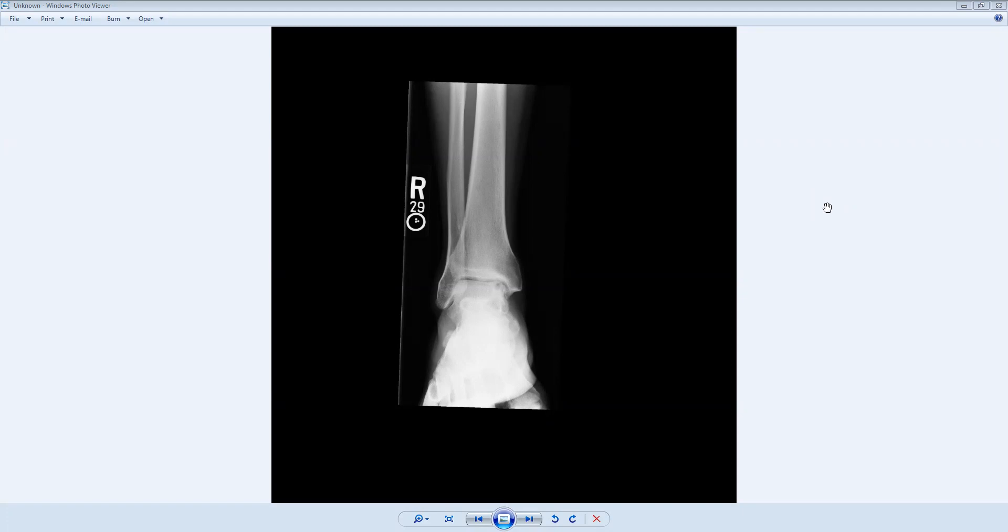This is a 23-year-old athlete complaining of right ankle pain. Usually when somebody has ankle pain, the first imaging study that one gets are x-rays of the ankle.